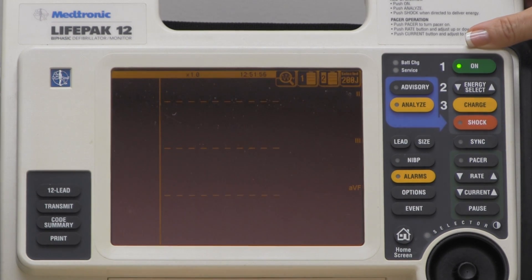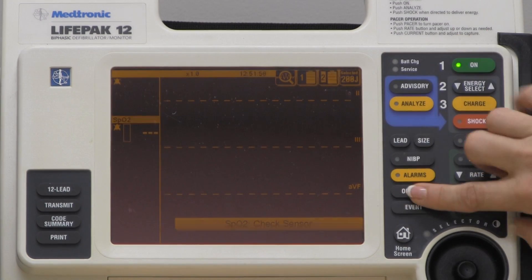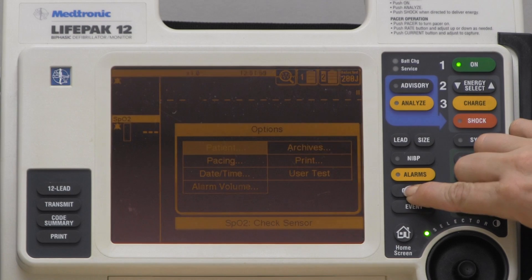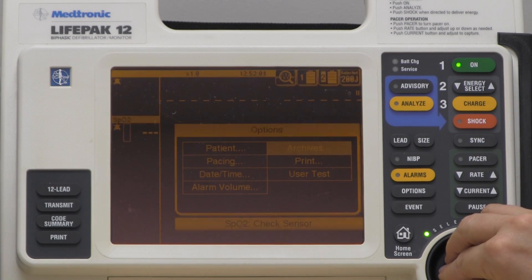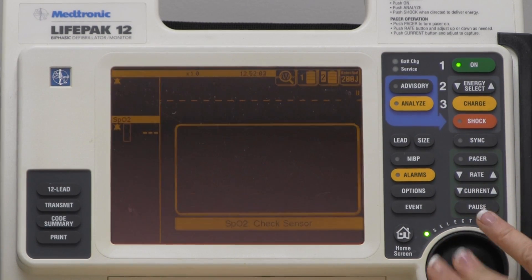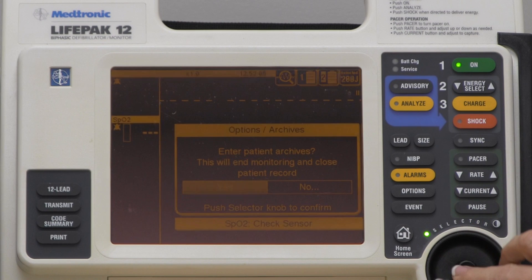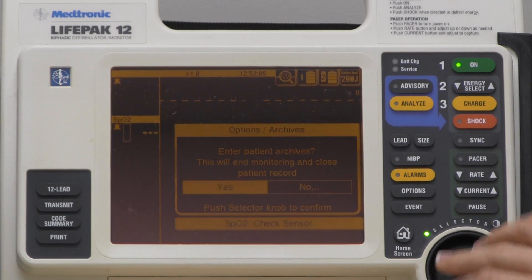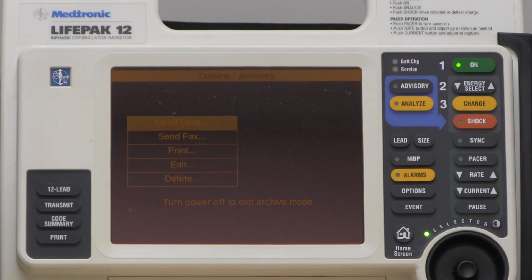I turn the monitor on, then I'm going to select Options. Out of Options, I will scroll to Archives and select it, then choose Yes for closing patient and entering Archives.